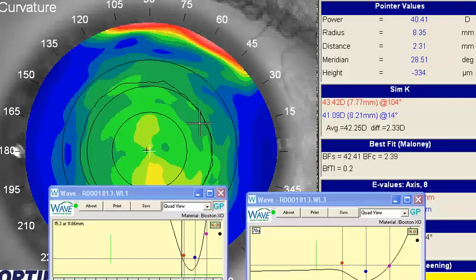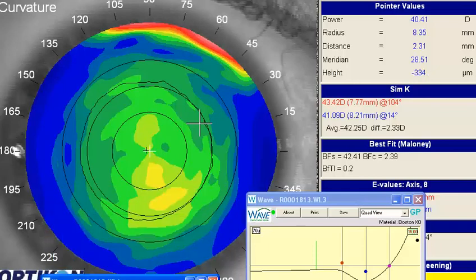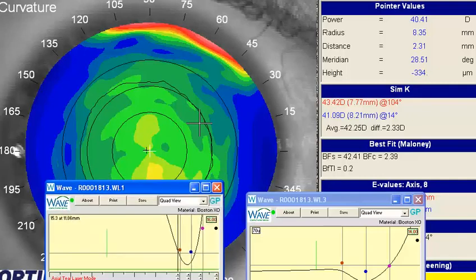So the best way to avoid that is to make sure, when you choose your original design, you don't average the astigmatism. What I find sometimes when you average the astigmatism, especially on some of these corneas, remember we're going to average the cylinder across this cornea, sometimes the overall sum of that average tends to become more spherical in general, so it tends to hide some of the true corneal cylinder. So I always try to make sure, if I can, to stay without averaging the cylinder.